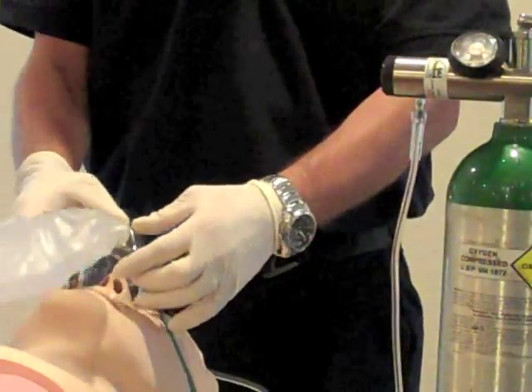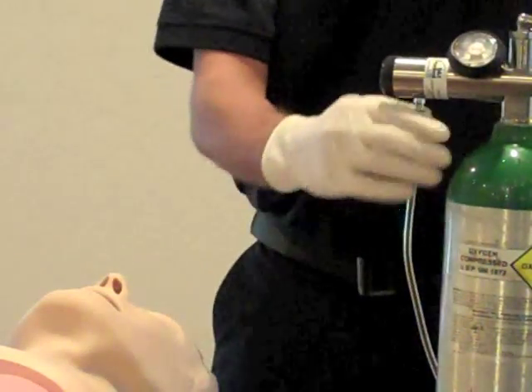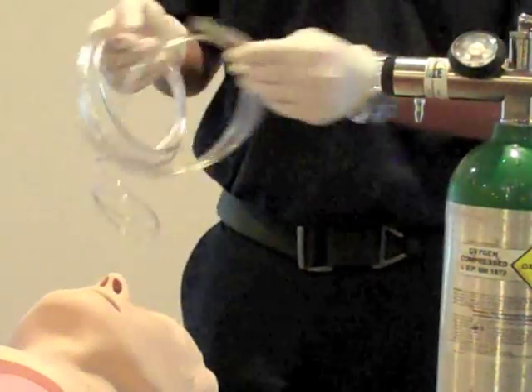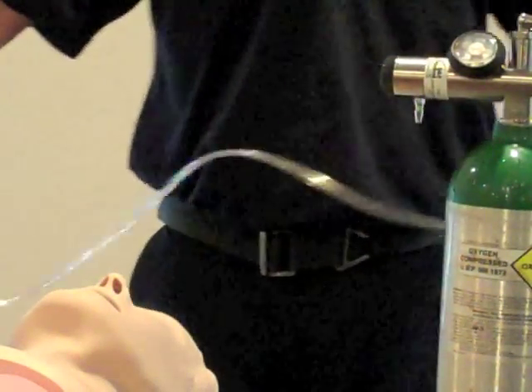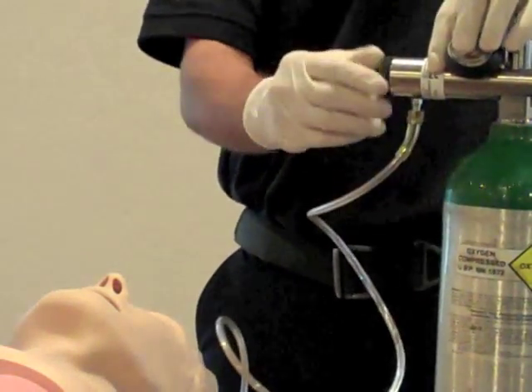If the patient is unable to tolerate the non-rebreather mask, remove it. Choose a nasal cannula and attach it to the port on the regulator. Adjust the liter flow to 6 liters per minute or less.